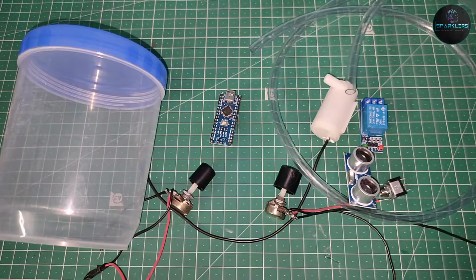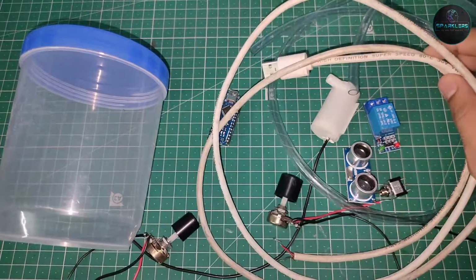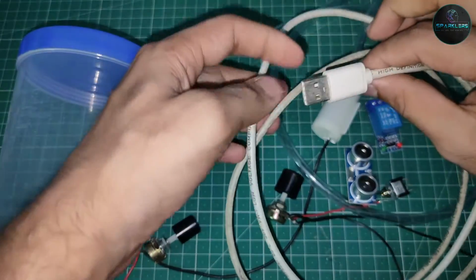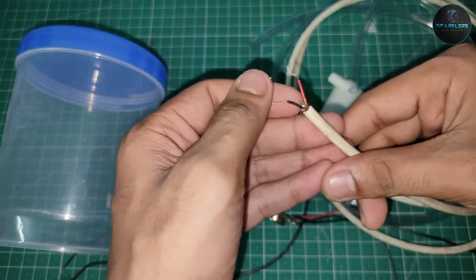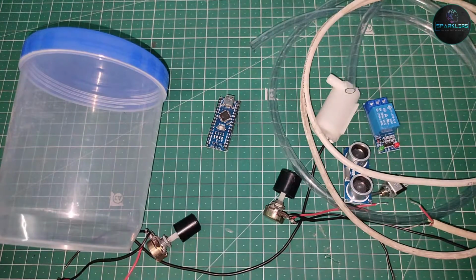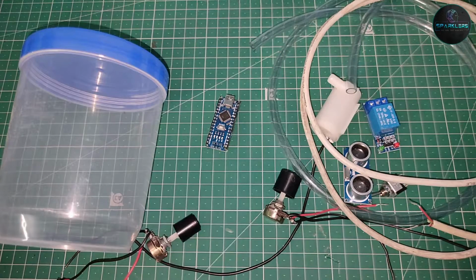And the final thing we need is the power supply. In my case, I will use a wall adapter and this micro USB wire. Basically, I will plug this into the 5-volt wall adapter, and then I will get 5 volts from here and give the 5 volts to all the components, because all the components here work on 5 volts, so there is no issue. But if you are using a 12-volt pump, in that case you have to take care of that. So this is all the things we need to build this.